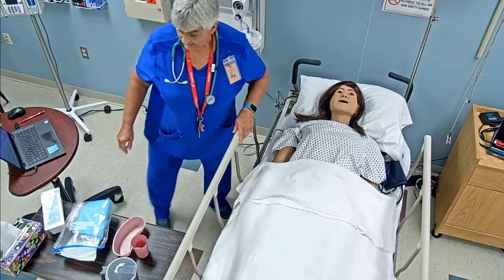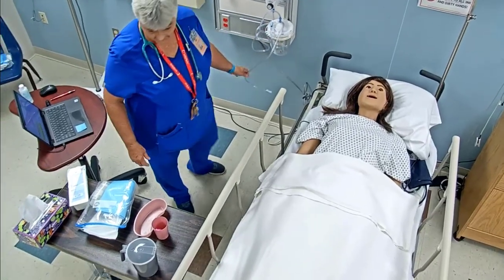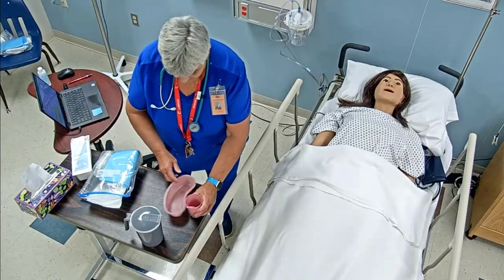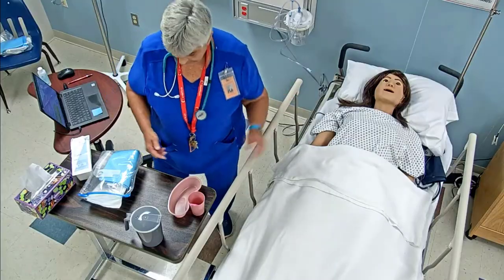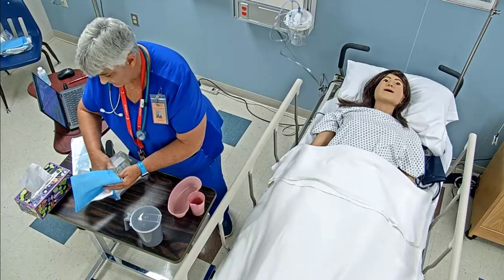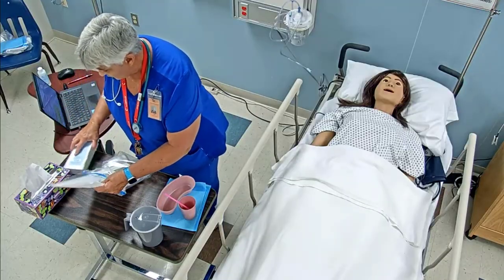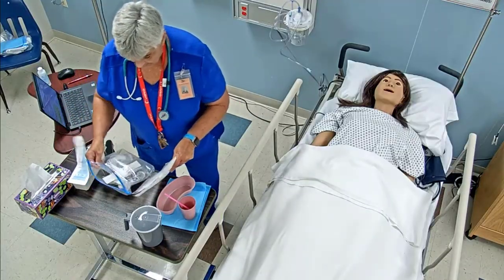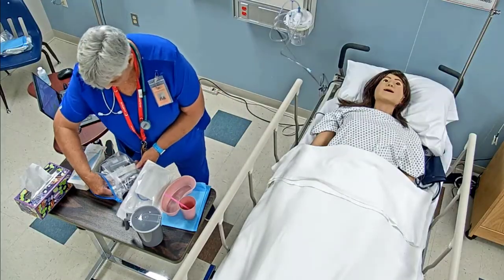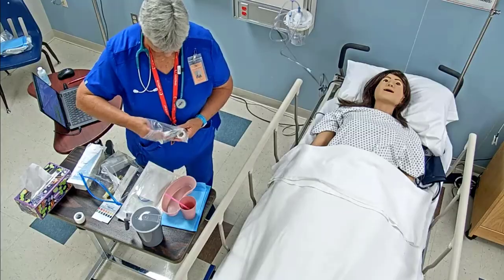Okay, well there's a couple of things that I need to do. I need to make sure that I've got my suction container connected here. I'm just going to get my stuff out. So I'm going to need an emesis basin and a cup for them to sip. Also need this for them to do that. It's going to give me just a minute to get everything ready here. Okay. I'm going to get all this stuff out. Get it set here.